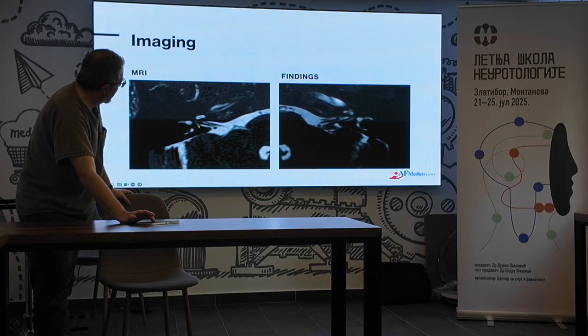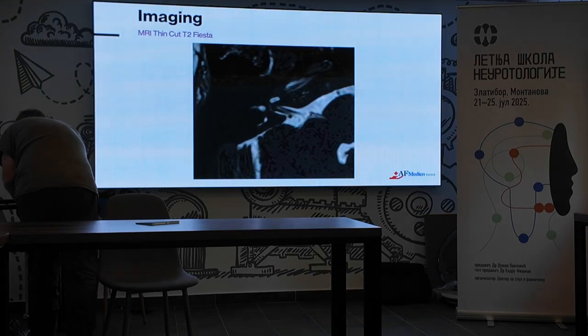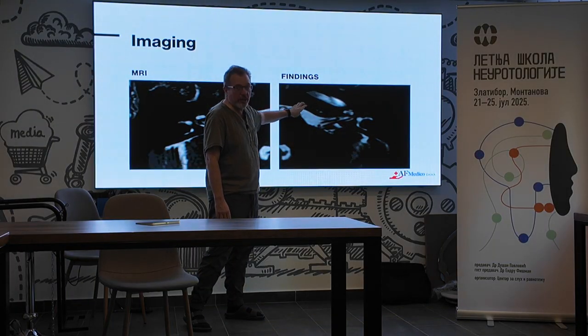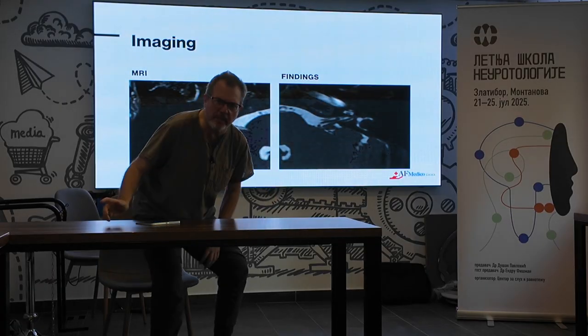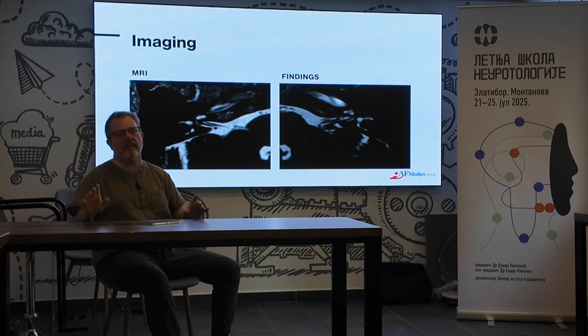And you can see here is actually a very small acoustic neuroma. Sorry, I have it on a different presentation, but this is the image that you need because just a few cuts higher is the trigeminal nerve. The trigeminal nerve is just a little above here, and you need this thin T2 type image to be able to see the nerve. And if there's the nerve and there's a vessel pushing against it, and they have classic symptoms, they will do very well from surgery.